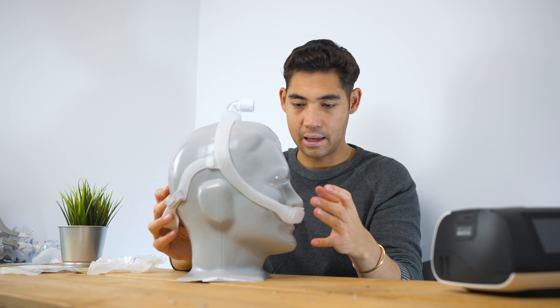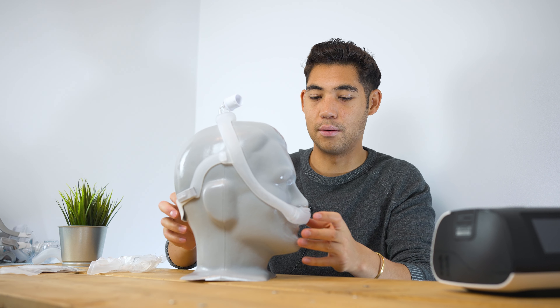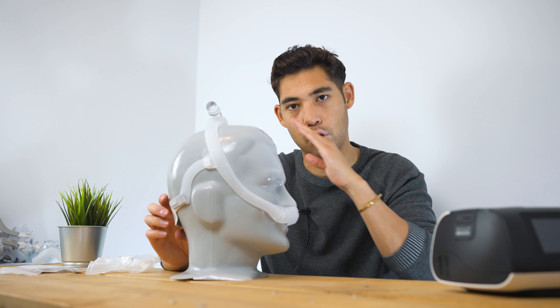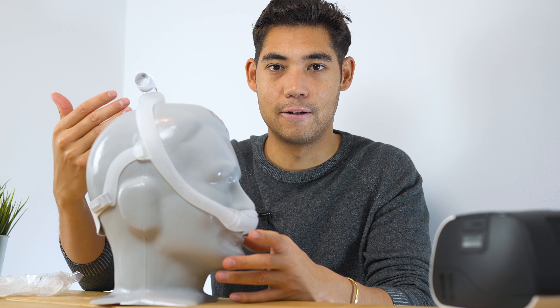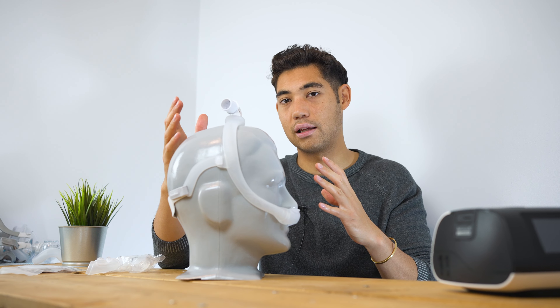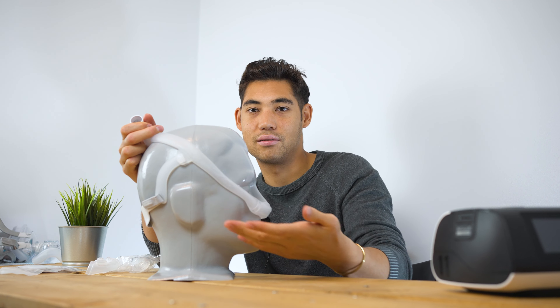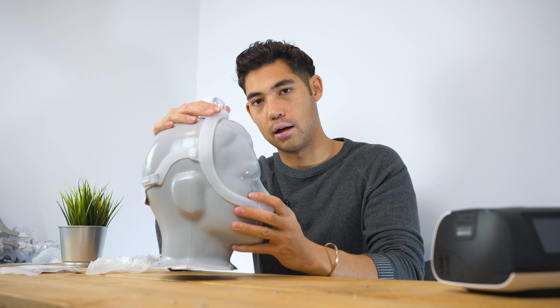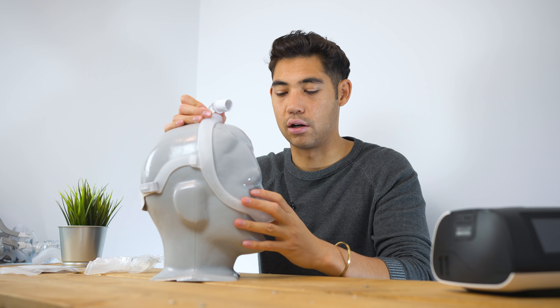If I'm sleeping on my back, however, it does fit well — I use the small, it seals, and it is a good mask. But one of the things to note is you're probably buying this mask because you roll around a lot — hence you want this style — and if you roll around a lot, you're probably going to be squishing your head in the pillow. I think one culprit for that leakage is the fact that you only have one area to tighten, and as it tightens, it pulls the mask back in a very linear fashion. It doesn't pull it up and snug the pillows underneath your nose very well. So no matter how much you tighten, leakage when your nose is squished on the side continuously occurs.